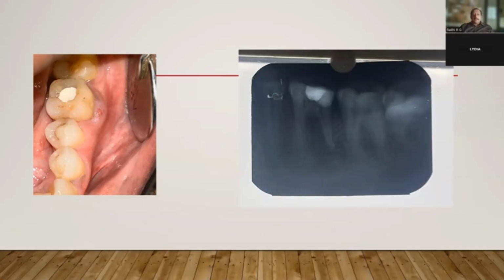And since on the X-ray you can see a furcation involvement, what we expect to see here is that, for some reason, a furcation involvement has happened on this tooth. That furcation involvement presently has a collection of pus. So it's a periodontal abscess which has got a draining point somewhere outside of the gingiva. So this is right now a sinus opening, from the furcation region.